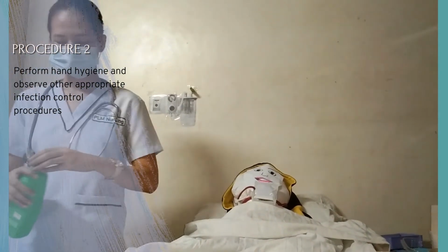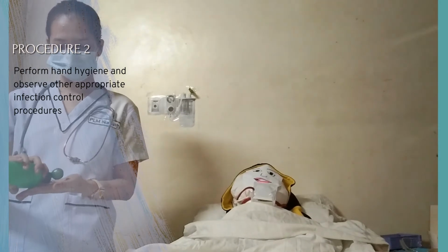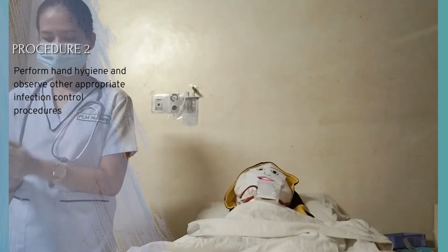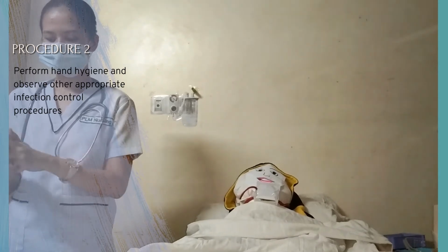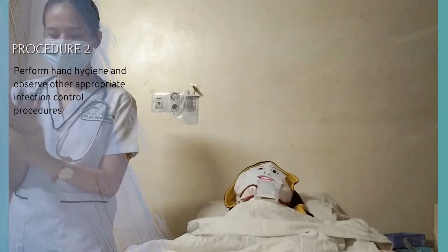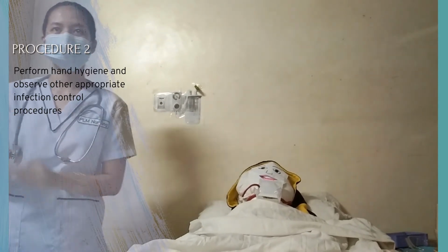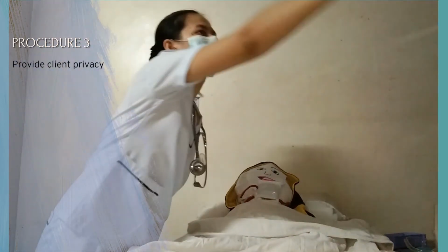Perform hand hygiene and observe other appropriate infection control procedures. Hand washing and gloving reduces transmission of microorganisms. Provide the client privacy. Ensuring privacy can promote more effective communication with the client and help prevent embarrassment and enhance autonomy.